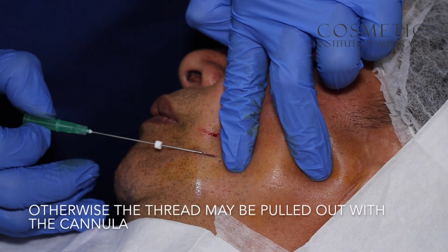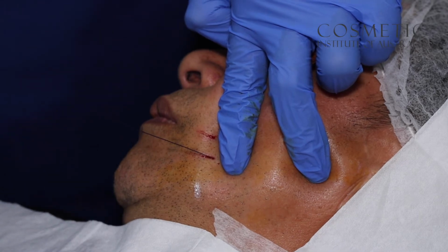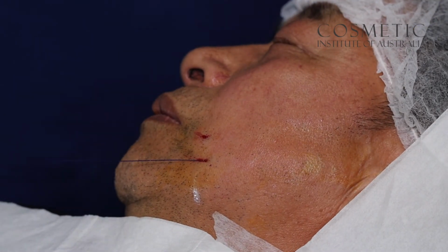When pulling out the cannula, press against the end of the thread. This engages the thread and ensures that it stays in place. Lastly, cut the excessive thread. It is best to cut the threads only after all the threads have been inserted.